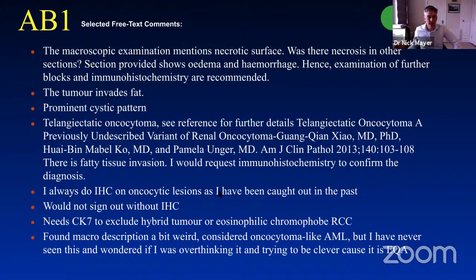A lot of comments were about additional immuno, and the fact that people generally would not sign out a case like this without having done some form of immuno. In a pink tumour with this type of morphology, CK7 and potentially c-KIT would be a reasonable sort of panel to think about doing, given the morphological differential.